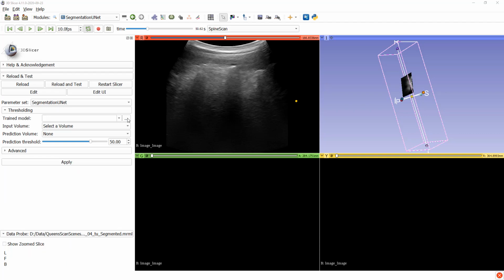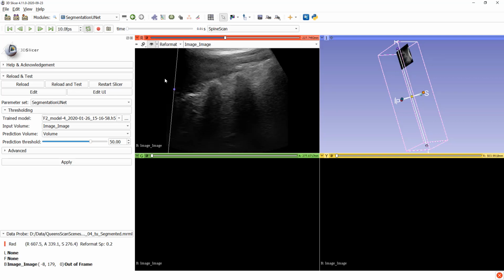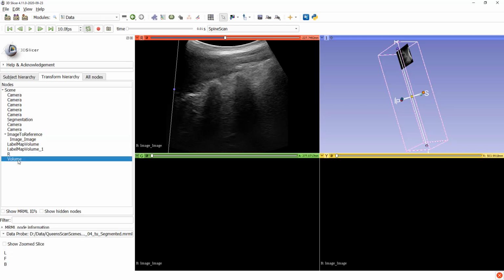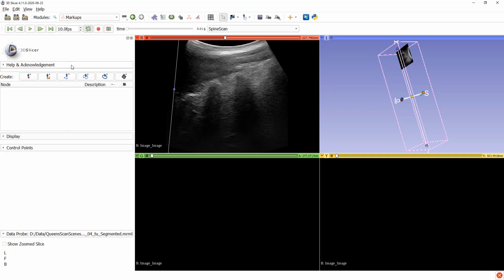And now we are using the segmentation U-Net example module. This is only a few dozen lines of code. It loads a Keras model, takes an input image, and creates an output image of the same size. It applies the U-Net and generates the prediction images live whenever the input ultrasound image changes. Of course, the output prediction image also needs to be transformed by the image to reference transformation.